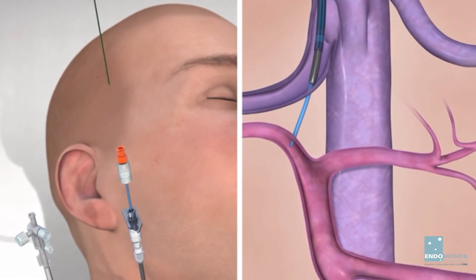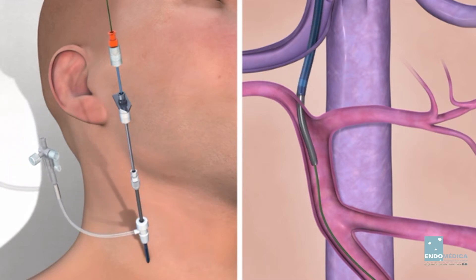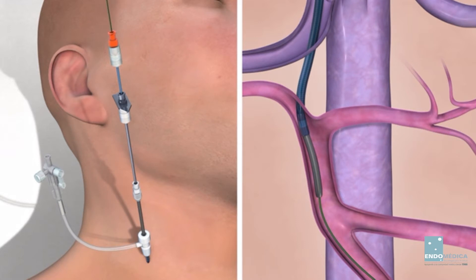Introduce a wire guide through the 5 French catheter into the portal branch and select the main portal vein. Hold the 14-gauge stiffening cannula in a stable position. Advance the 10 French TFE catheter and the introducer sheath over the 5 French catheter and wire guide. Continue to advance until they are positioned across the parenchymal tract.